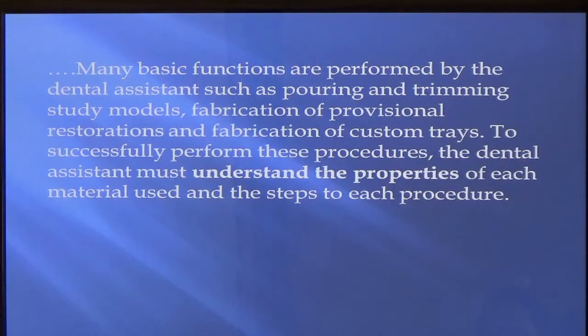Many functions are performed by the dental assistant, such as pouring the model, trimming the model, fabrication of provisionals, or custom trays. This is big. To successfully perform these procedures, the dental assistant must understand the properties of each material used in the steps.